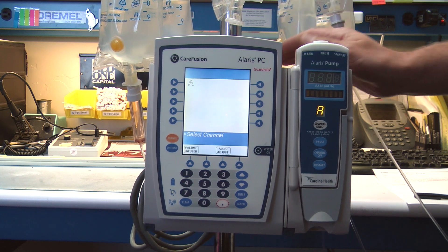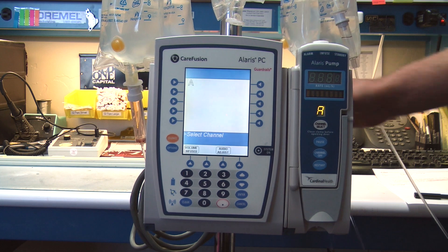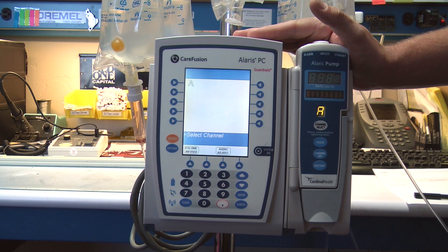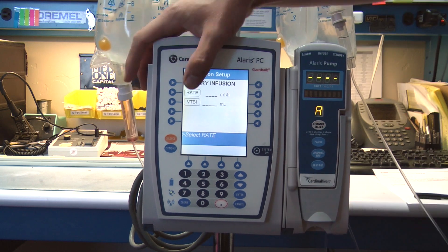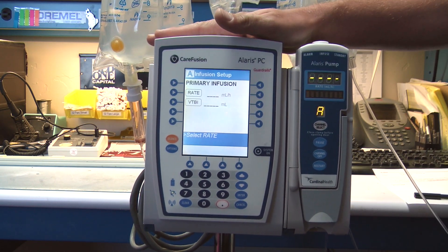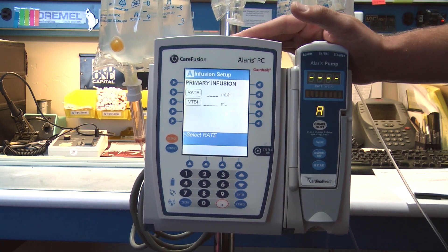You can mount it to the pole clamps very easily, and to start your patient infusion on this pump is very simple. You just select the channel and then from your main menu here you can choose your rate and volume to be infused. And if you have a custom drug library set up on your PCU for your hospital, you're able to access that very easily and make any drug calculations that you need.